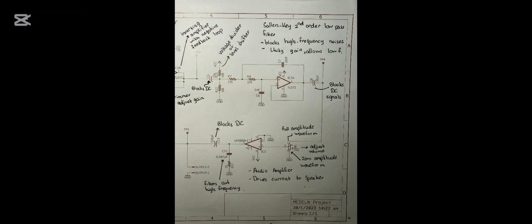In stage 4, the signal waveform passes through the coupling capacitor to filter out the DC signal. And hence, it enters the third IC, the LM386N, which is the audio amplifier that drives the speaker. So the function of this stage is to power up the waveform to be strong enough to drive the speaker. The IC works in single supply mode internally, so we don't need to provide it with any voltage. So it is the only op-amp that drives current to power up the speaker.